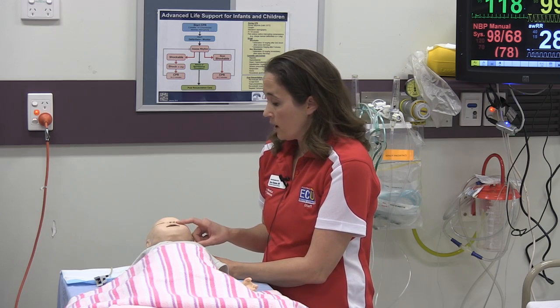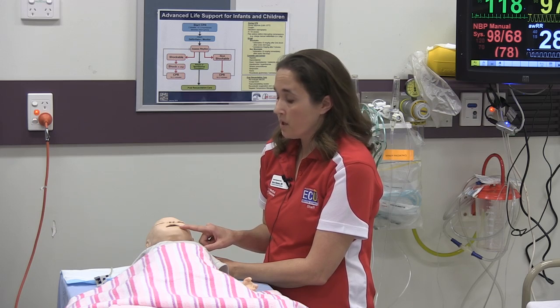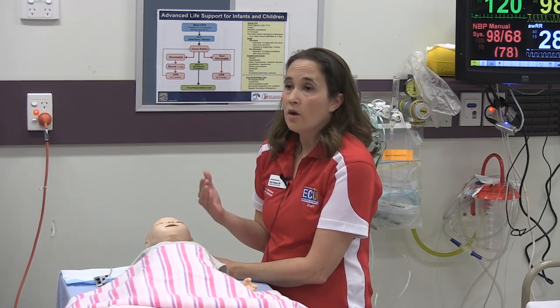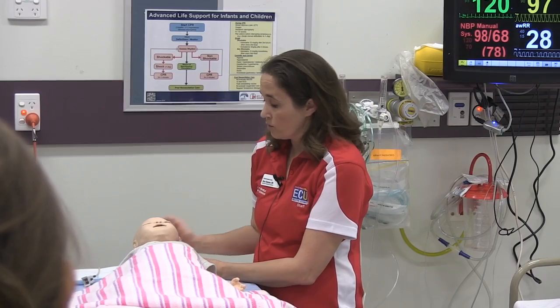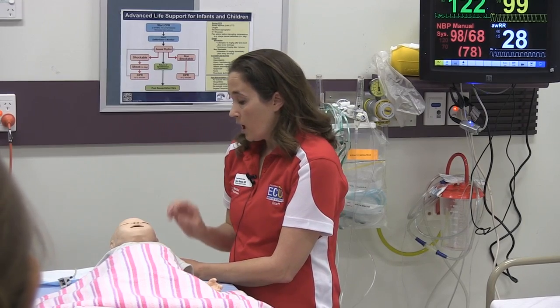You can put in a nasal airway. You can do an oral airway, an LMA. You can intubate this baby. You can do laryngospasm, you can make the tongue swell, tongue edema. These are all things that you can set on the mannequin console, which we'll show you a little bit later. And they're basically pretty easy check boxes that you can click.